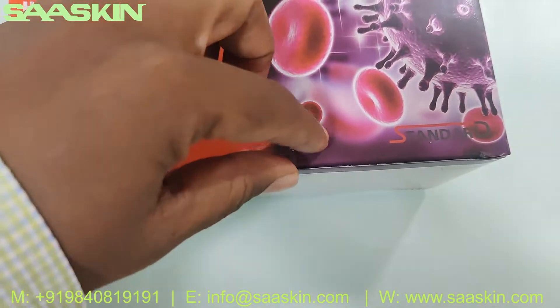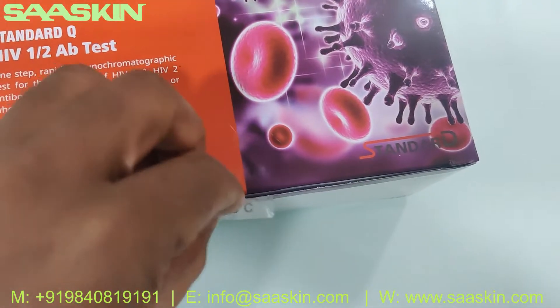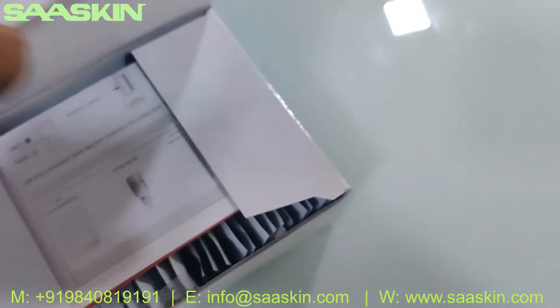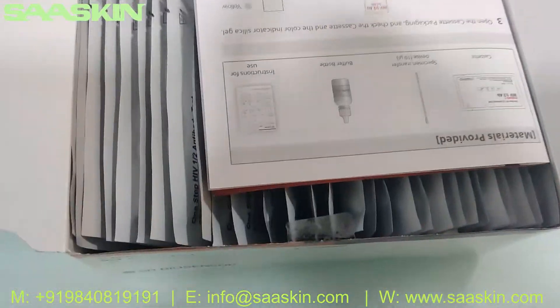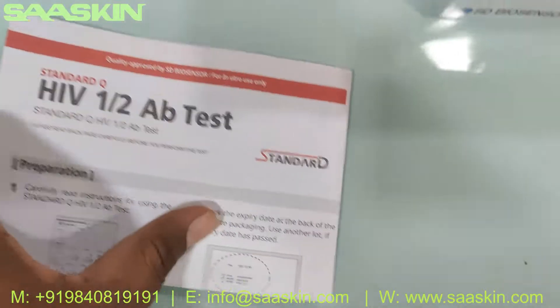Let me open this box. This is how the inside of the box looks like, and inside the box you can see there is one instruction for use brochure.